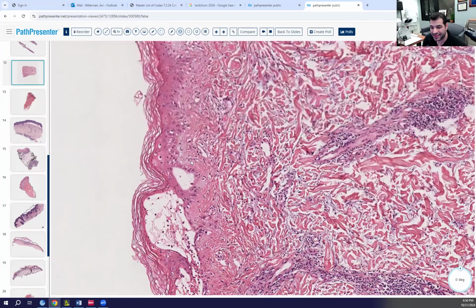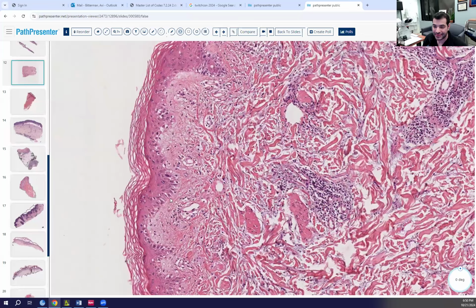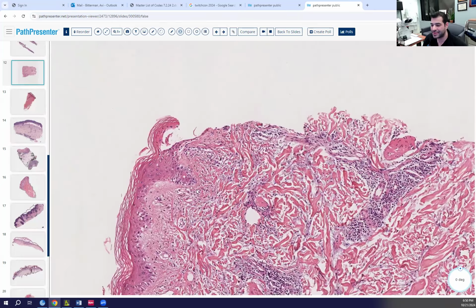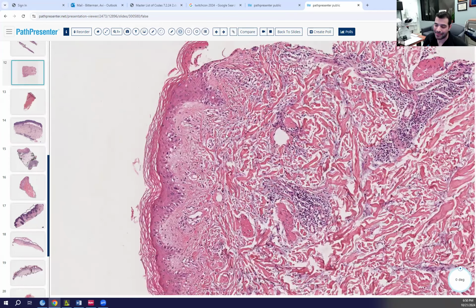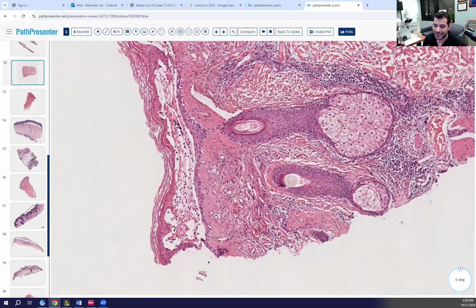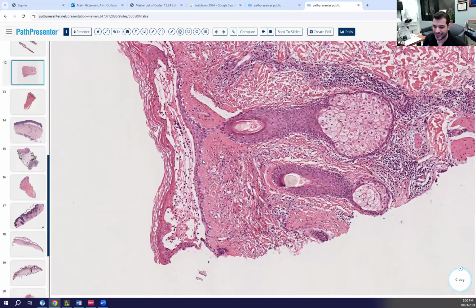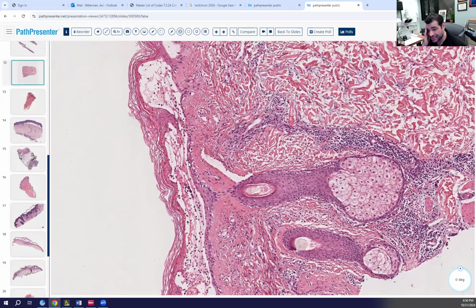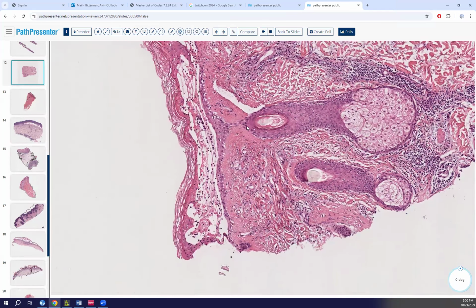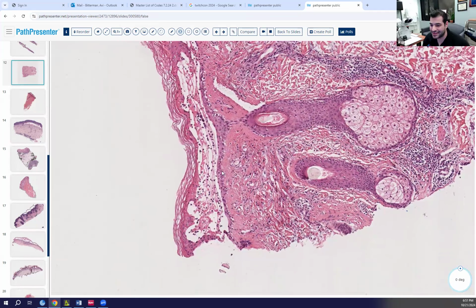So sometimes when we get a split, you can see this where I'm having trouble deciding if it's subepidermal or intraepidermal, because the deepest areas go to the base, but sometimes I might see this area.